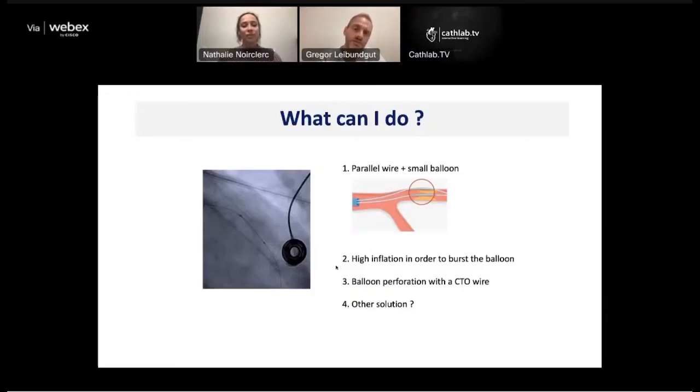Just make sure your balloon is very well deflated or de-aired and completely filled with either saline or contrast, and then you just go up. The ruptured balloon doesn't help at all. It makes everything worse, because then you have plastic pieces laying inside the stent and it gets even more entangled. However, these balloons, they go well over rated burst pressure. So I'm sure if this is a stent balloon, you can go up to 22 atmospheres, and your likeliness that the stent will eventually expand at 20, 21 is very high, and you get free of your issue. So I would have done 2nd.